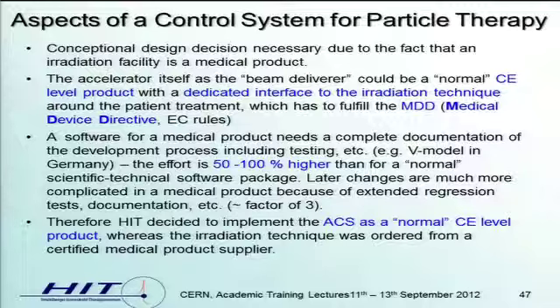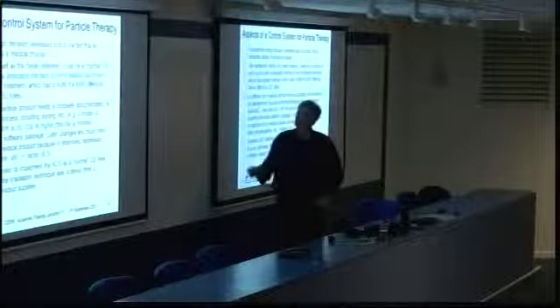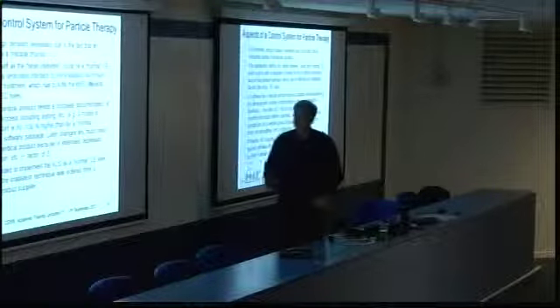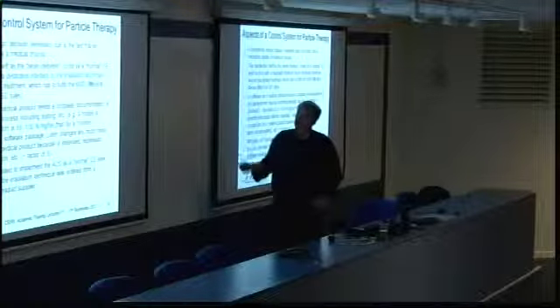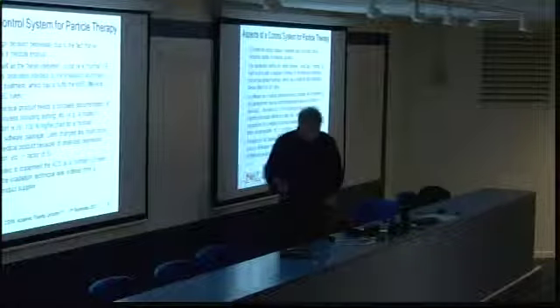And if you produce a medical product, then you have to fulfill the medical device directive. These are European rules, and there are more or less similar things in the US FDA rules. And to fulfill them is a hard task.